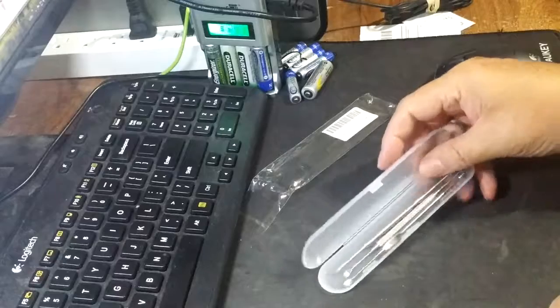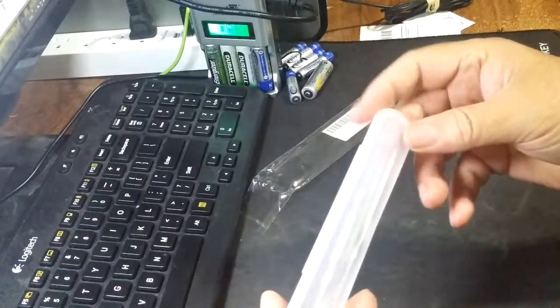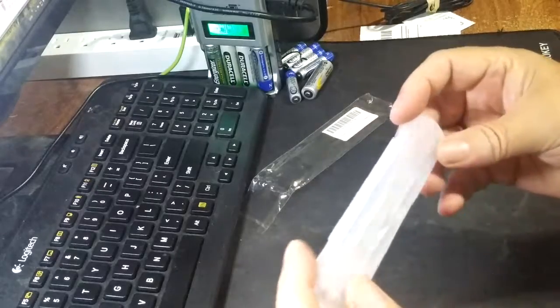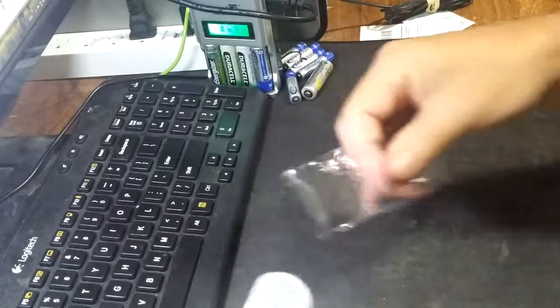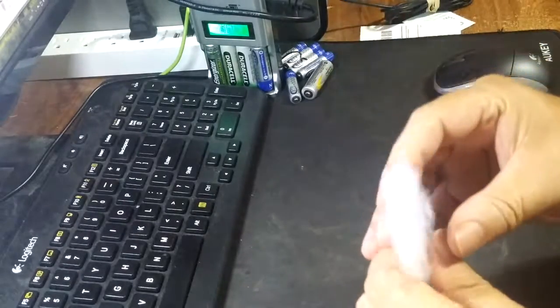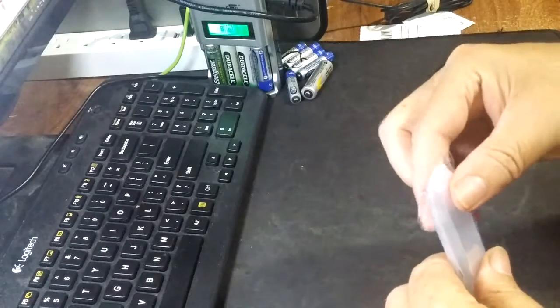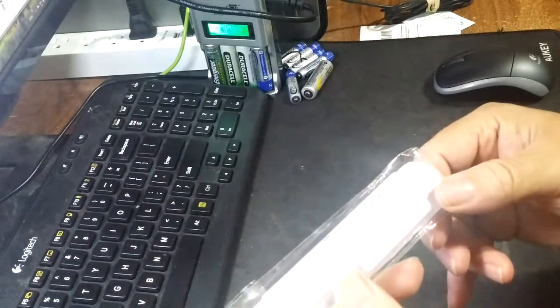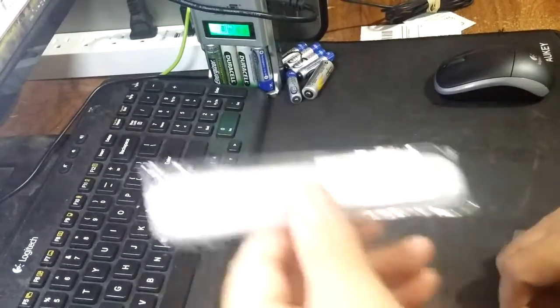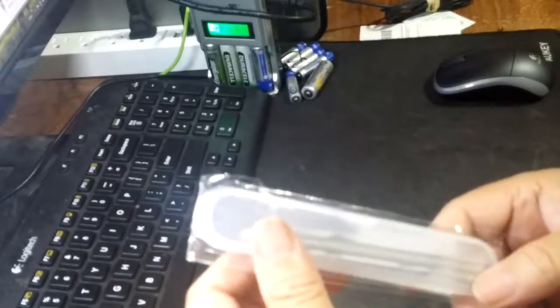And a nice little case to keep them all together. From Mudder, three-piece. Very nice, very handy. Makes an unusual gift — in this case, a welcome gift, I'm sure.